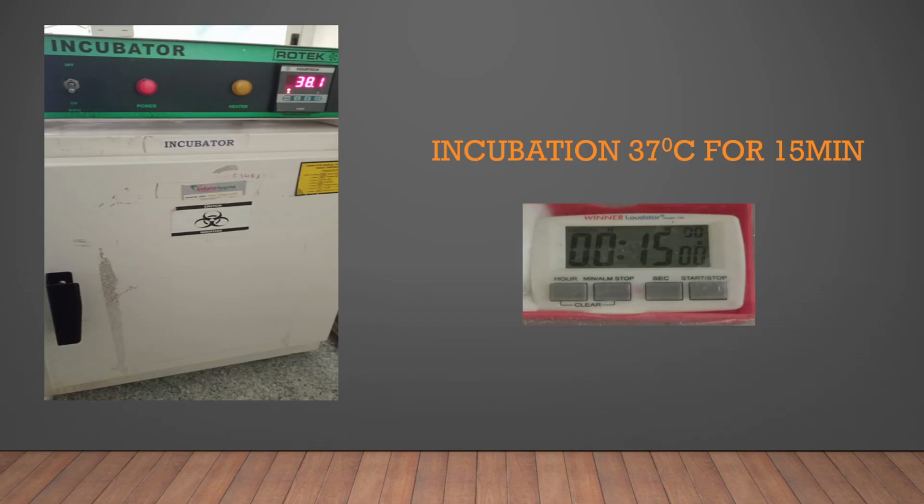If by mistake you have not kept the timer and you have missed it, then you have to redo the whole procedure. So don't continue. Maximum you will keep it for 20 minutes.